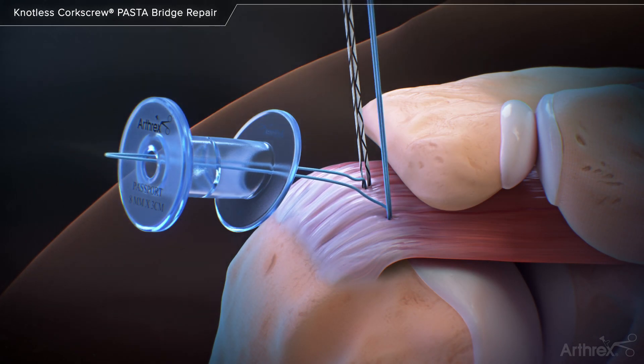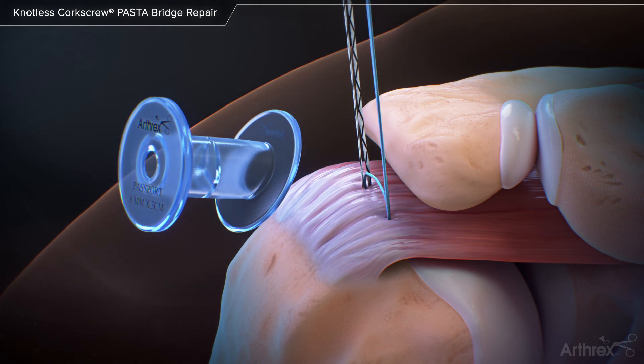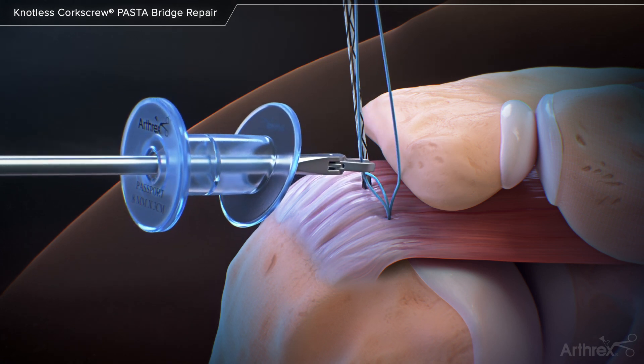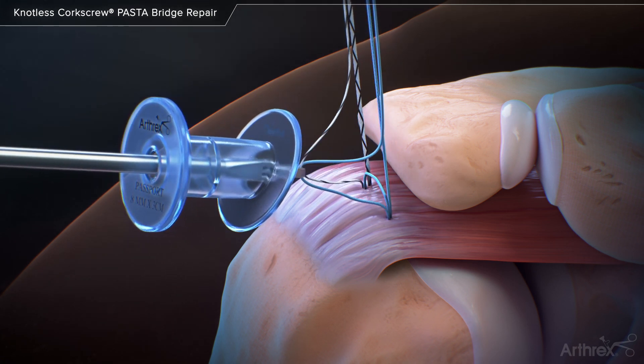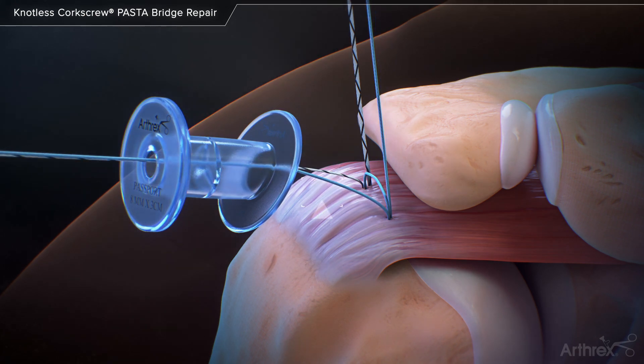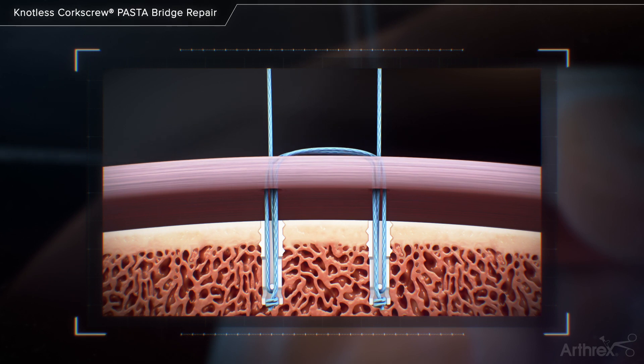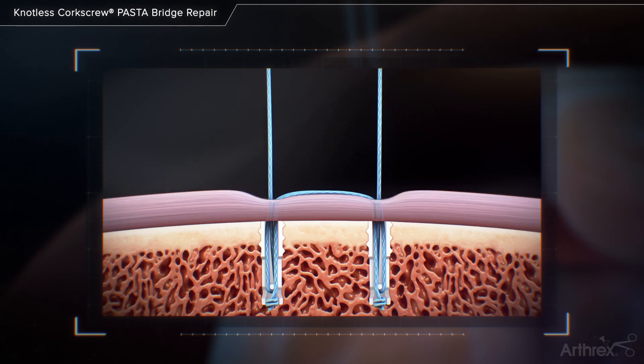The suture is pulled down to the rotator cuff, but not fully tensioned. Next, repeat the previous shuttling steps with the other repair suture and round fiber-link tail. At this point, both sutures are pulled to tension the bridging sutures between the anchors, reducing the medial tissue to bone.